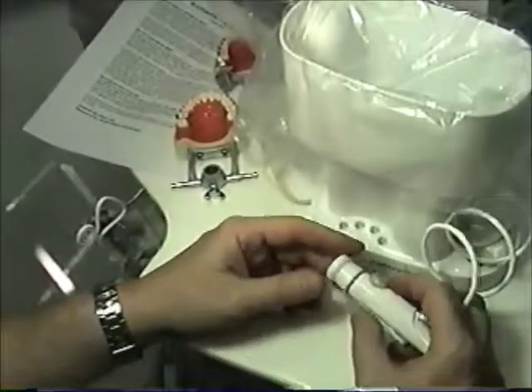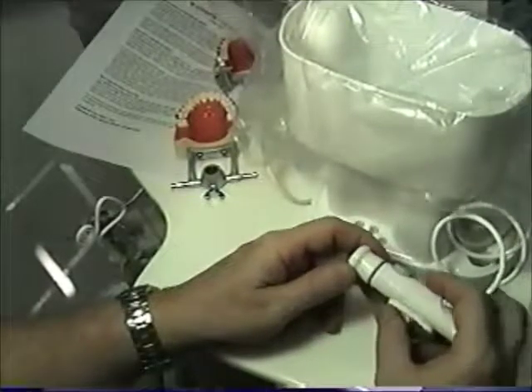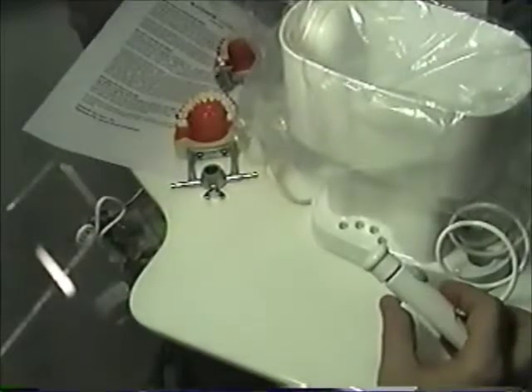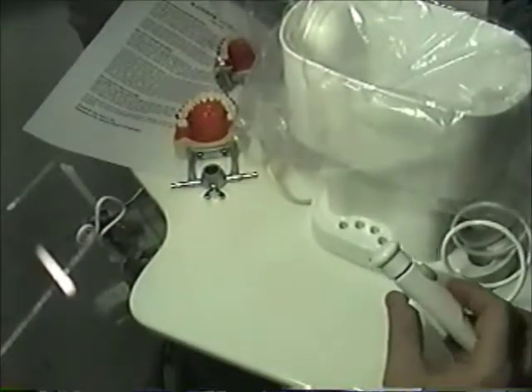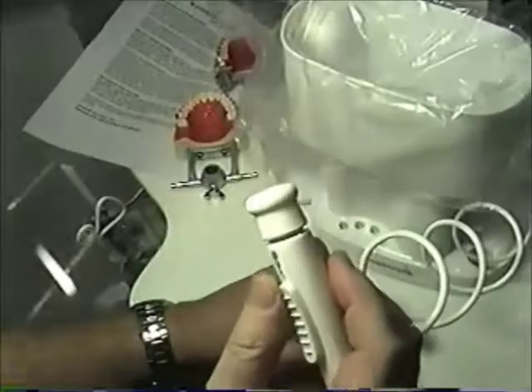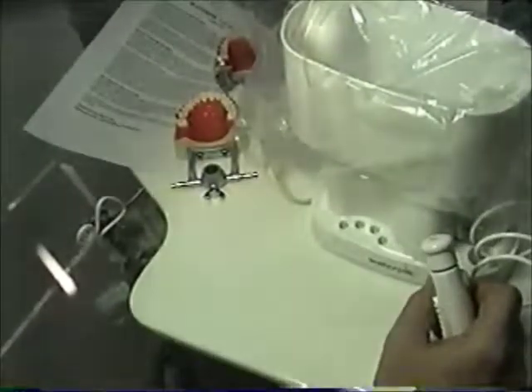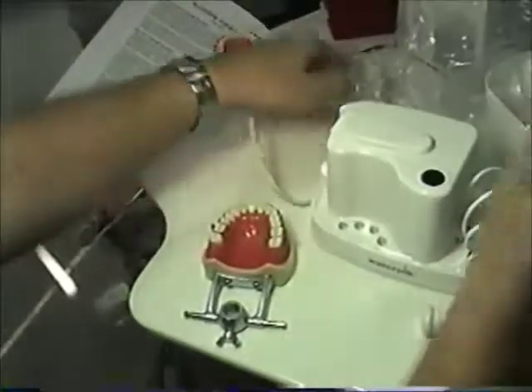So what I recommend is you stand on the outside of the shower or the bathtub, and you put the shower curtain kind of around you in a neat fashion, like a toga party sort of thing. Do not get in the bathtub because you don't want to get electrocuted, but you can take this wand over, get it close to the bathtub, lean your head over the bathtub, and just keep your mouth open and let the water shoot all around your teeth with this probe.